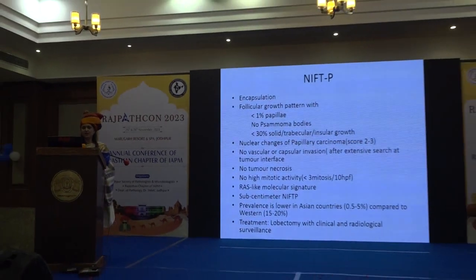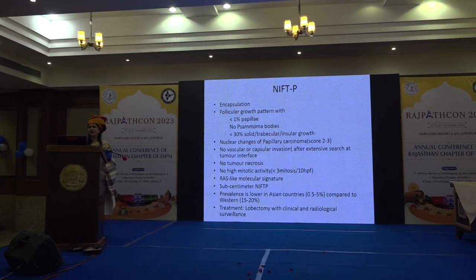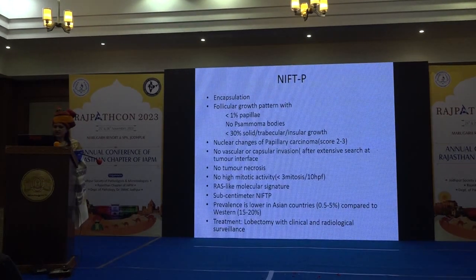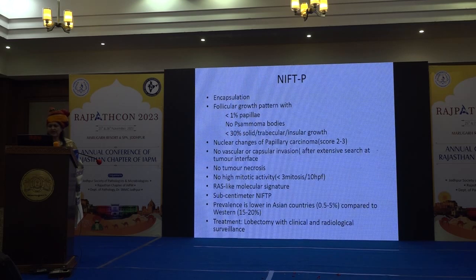If you see this, then you label that case as an invasive encapsulated follicular carcinoma with papillary features. So the prognosis totally changes, and there are mutational characteristic changes. That is the reason before giving the diagnosis of NIFTP, you have to be quite sure an extensive search for capsular invasion has been done. There is always no tumor necrosis, there is no high mitotic activity, mitosis will always be less than 3, and there is a RAS-like molecular signature, and that is the reason it is separated from papillary carcinoma.